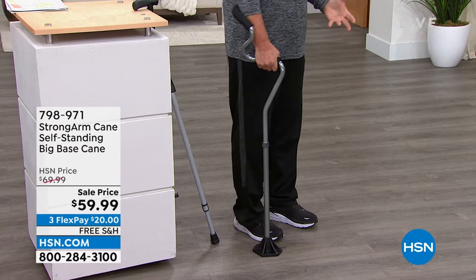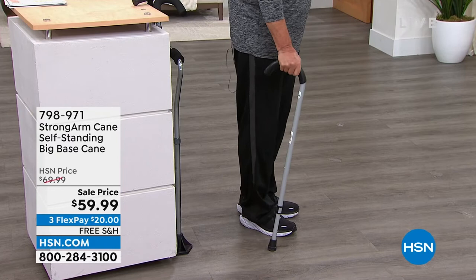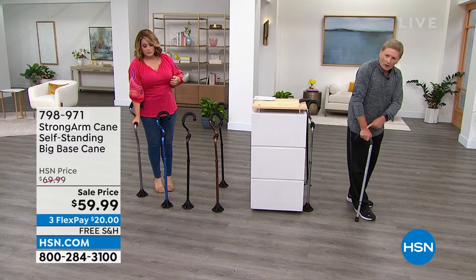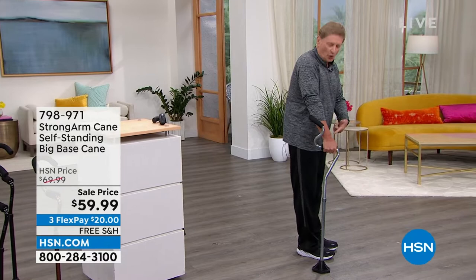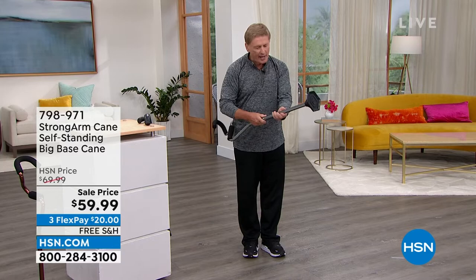Look at the posture as well — let me give you a comparison. If you're using a regular cane, look at the posture of my back: to go forward you have to lean forward, putting pressure on your wrist and your back. You can take a tumble. But with the comfort cane, my posture is up and I'm moving — no pressure on the wrist, it's shifted to the forearm in that cushion cradle. And if you're traveling on an airplane, just twist it and it'll fit in the overhead without a problem.